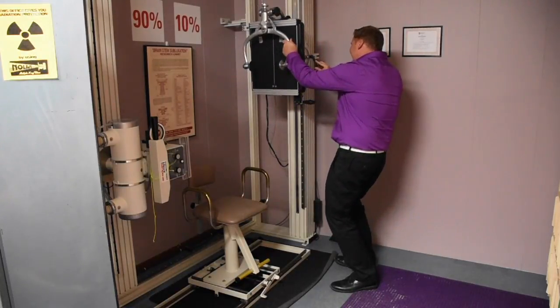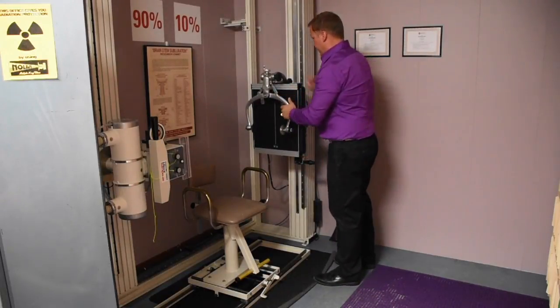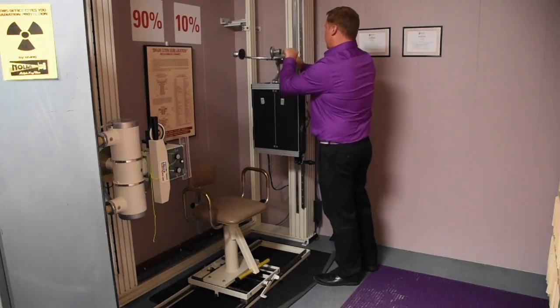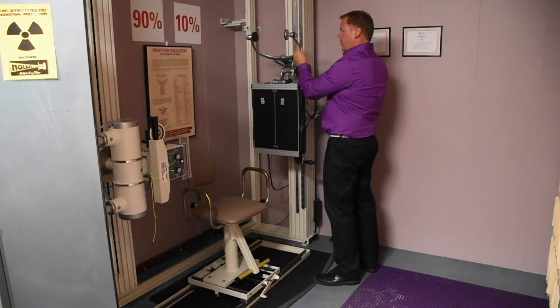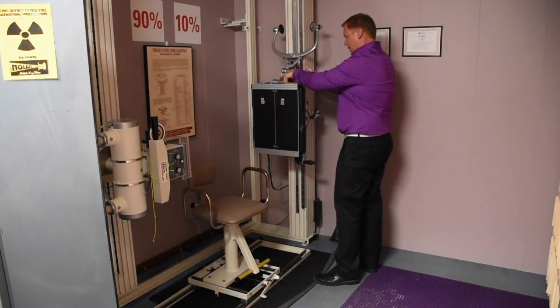We want to put the bucky back at 90 degrees and lock here. Lower this down, then loosen and loosen. As we talked about in the other video, we don't want to leave it like this — we want to leave it slightly backwards. Make sure both are locked.